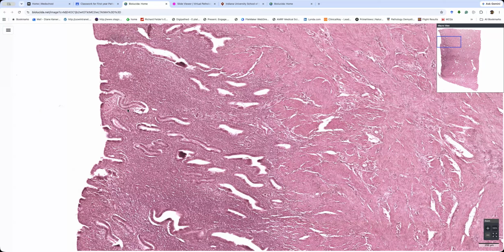pretty poor one. And in fact, some of the uteruses we get, of course, are in women with abnormal uterine bleeding because of fibroids or something, and they're old. The luteal phases aren't as good as they used to be. But this is still secretory. Okay.